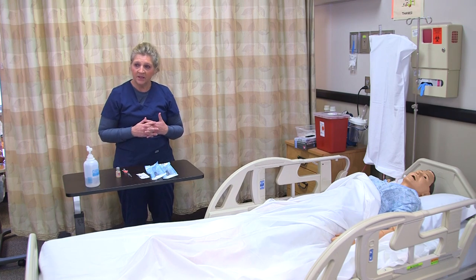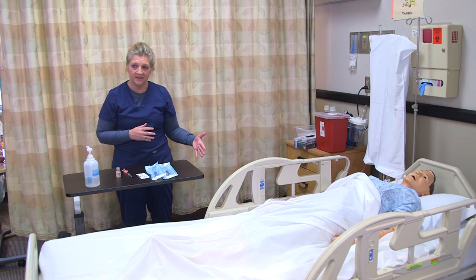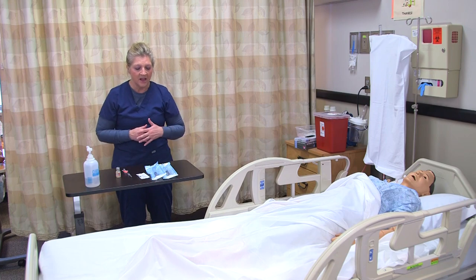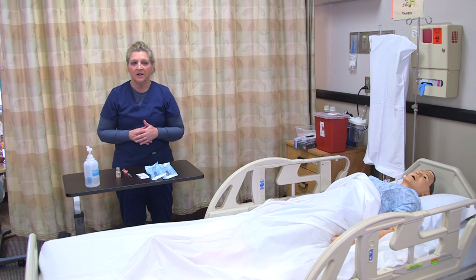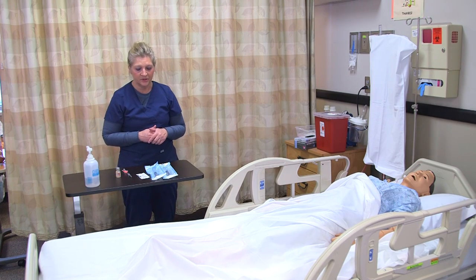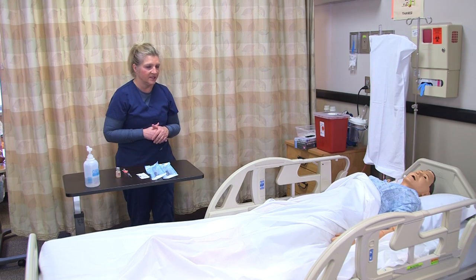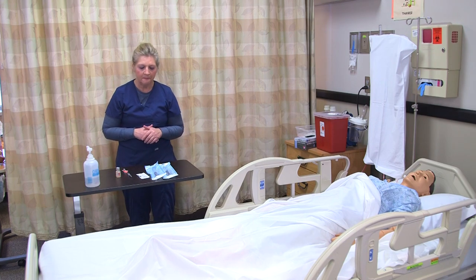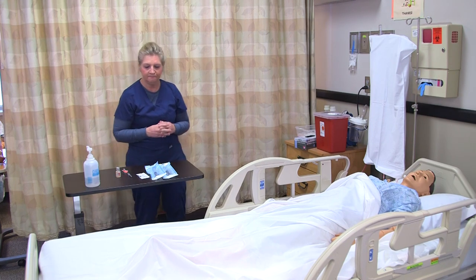I brought my supplies into the room. Since the patient has a saline lock, I have two prefilled normal saline preservative-free flushes with me as well as my disinfectant.